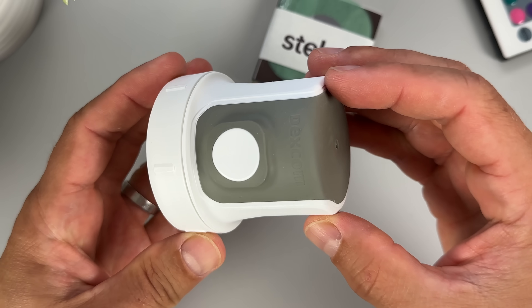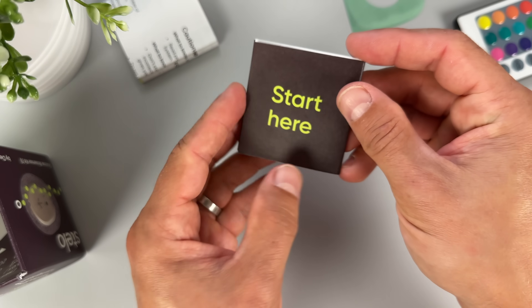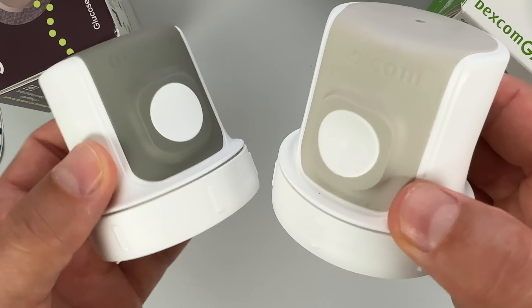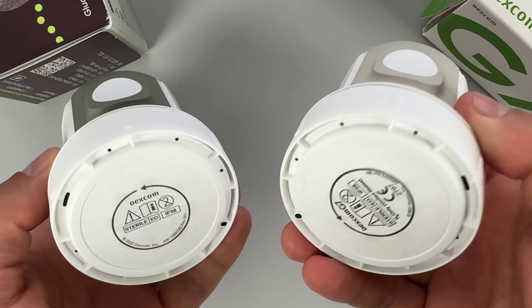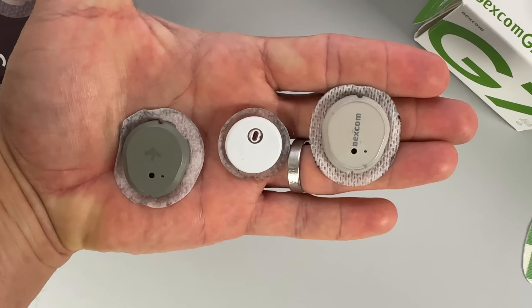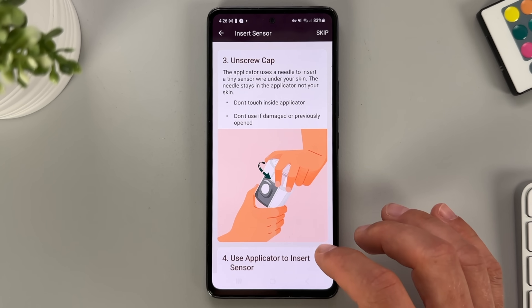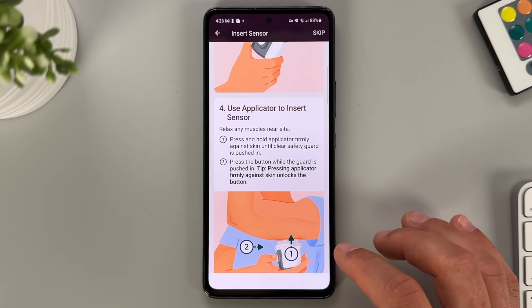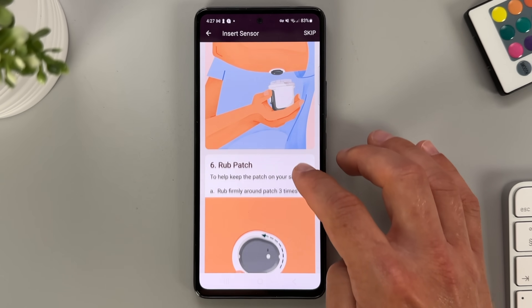In the package we found the all-in-one waterproof biosensor with the applicator, Dexcom's overpatch, and the quick start guide. The applicator is almost identical to the Dexcom G7 applicator, just a bit darker, and the same goes for the Stello sensor itself — similar form factor, just a darker shade of gray with the Stello logo on it. Before you apply your first sensor you need to download the Stello app from your App Store or Google Play Store. The app walks you through the setup process step by step and teaches you how to apply the Stello sensor and how exactly it works.